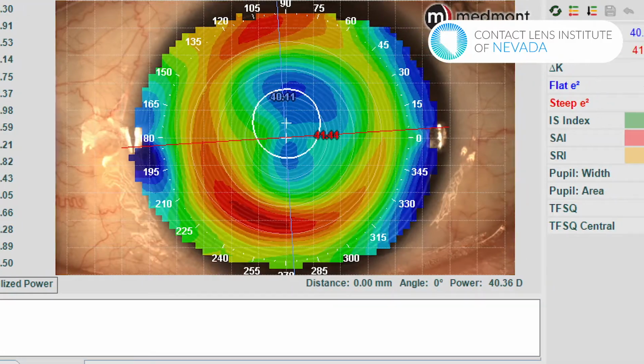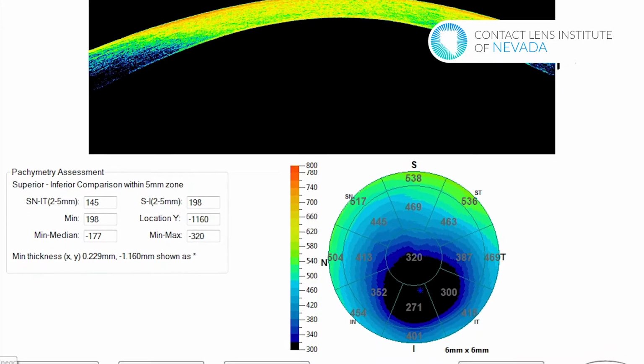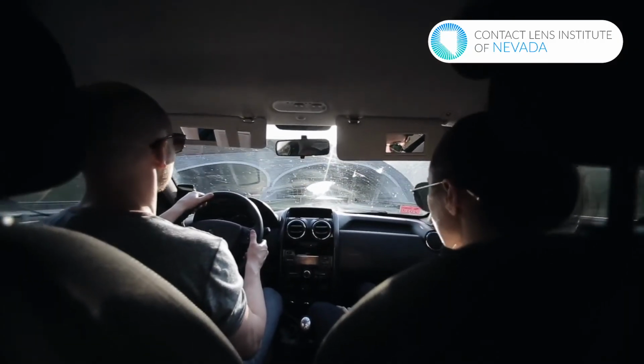If you are a good candidate, then they will send you to the surgeon's office, unless that's the doctor you're already seeing, and they will also do a series of images to confirm that you are in fact a good candidate. Once they determine that, they'll do a variety of measurements and put things into the laser to make sure that everything goes as flawlessly as possible during your actual surgery. When you get to the eye center, you always have somebody to drive you. You're not going to drive yourself.